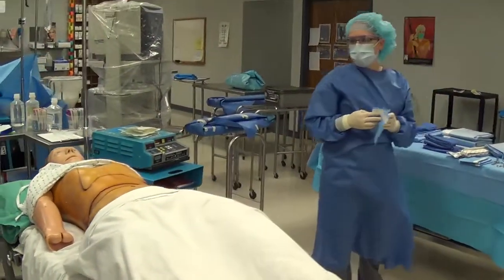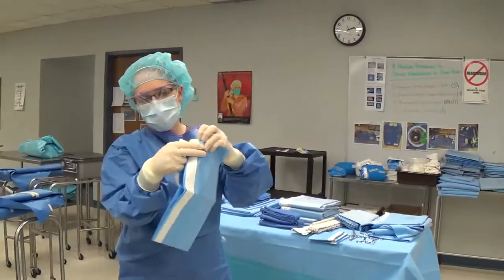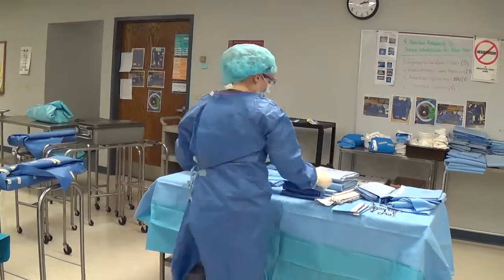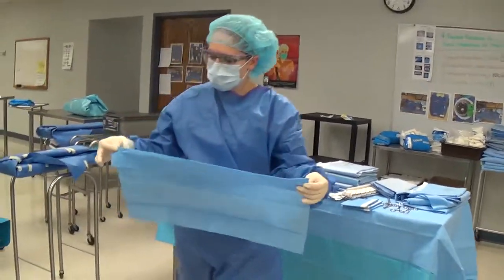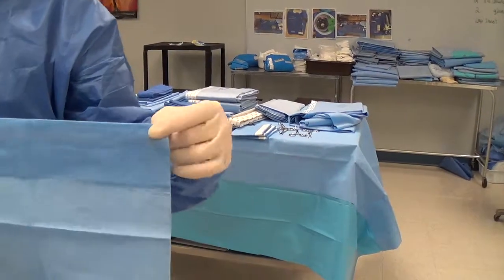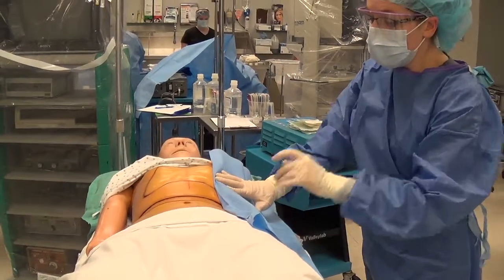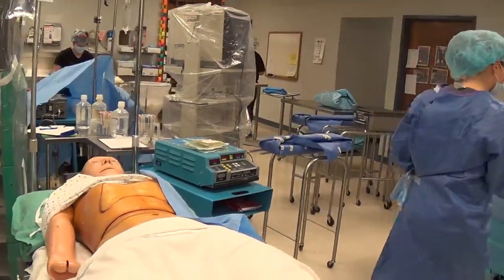It's surgeon's preference whether to use linen or paper drapes. With paper utility drapes, either keep them folded in half and pull the paper to expose the adhesive, rather than opening all the way and reaching below sterile level, or lay them on the back table and peel the paper off. Keep your gloves off the adhesive area because it's very sticky — grab either above or below it. Make the fold away from you, cuff your hands, and place the towel in front of us first. Unlike linen towels, once the paper drape is down you cannot slide it back, so position it correctly before placing.